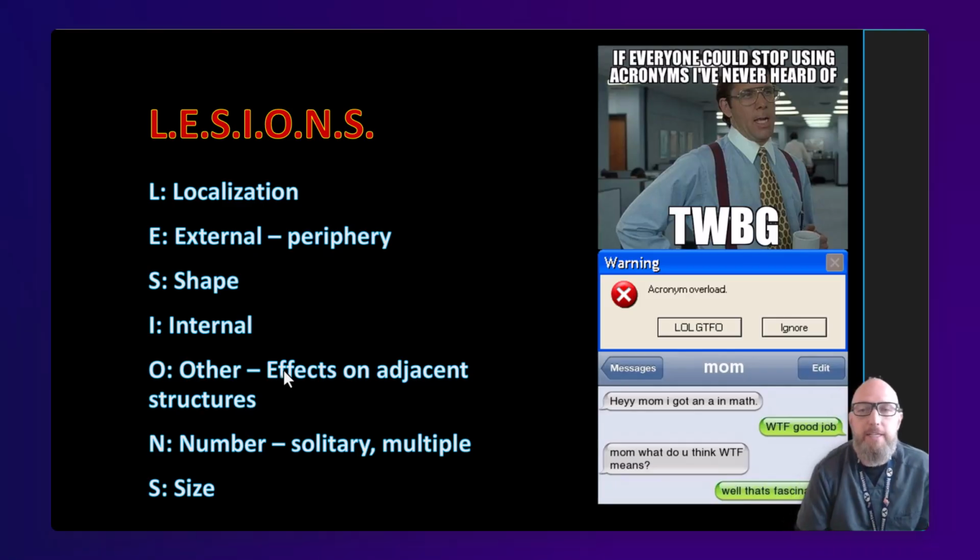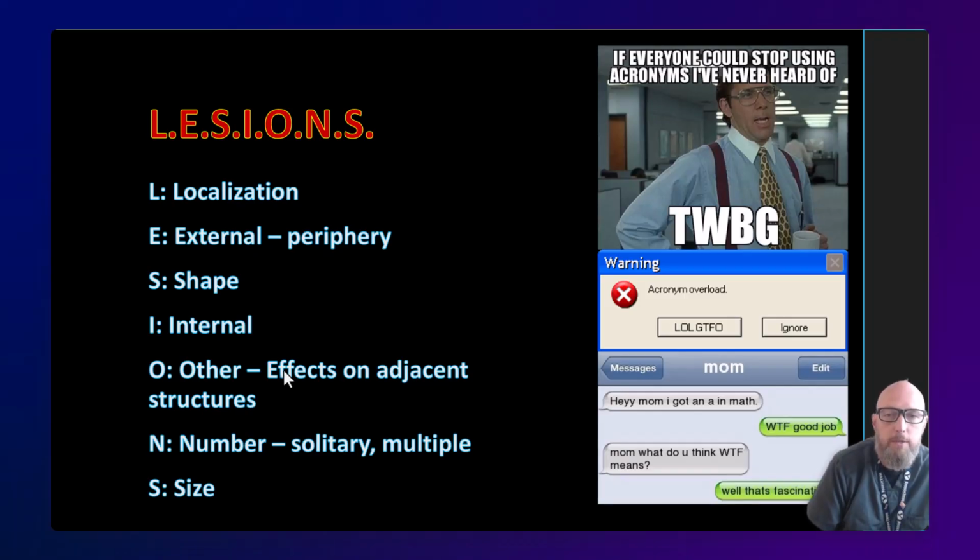In the next part, we're going to dive into the first letter, location. It's the single biggest discriminator you have. And so there's a real reason real estate agents say location, location, location.